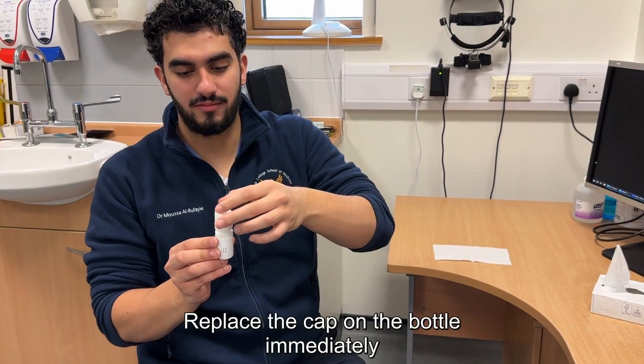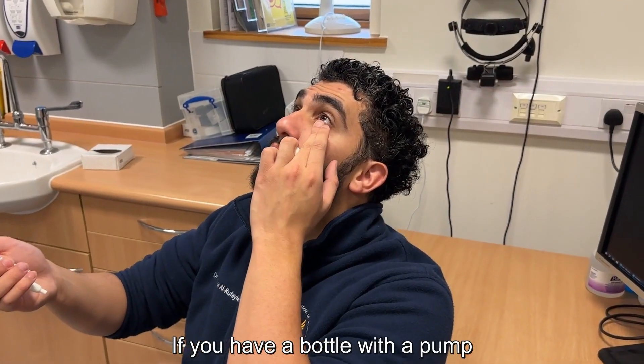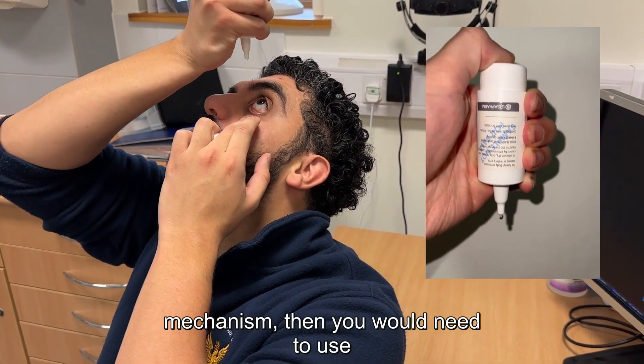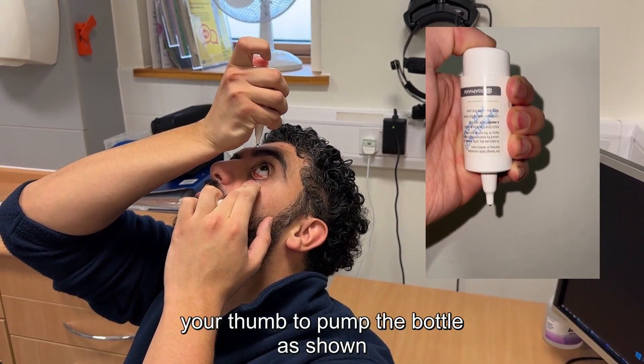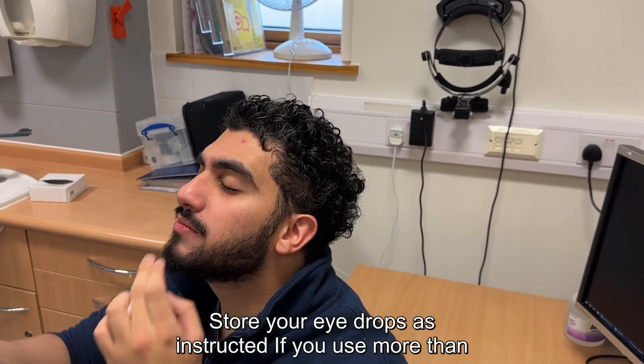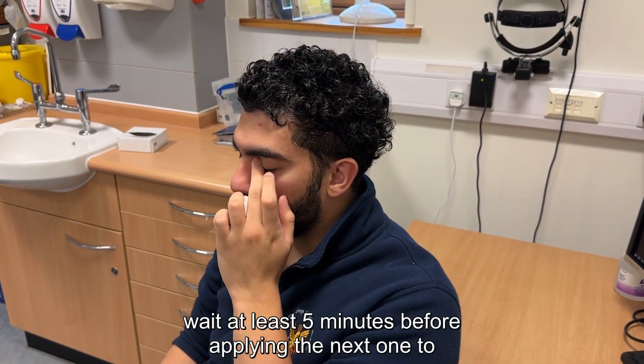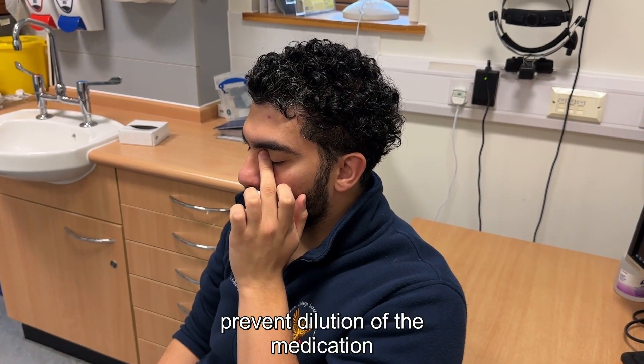Replace the cap on the bottle immediately without touching the dropper. If you have a bottle with a pump mechanism, you would need to use your thumb to pump the bottle as shown here. Store your eye drops as instructed. If you use more than one type of eye drop, wait at least five minutes before applying the next one to prevent dilution of the medication.